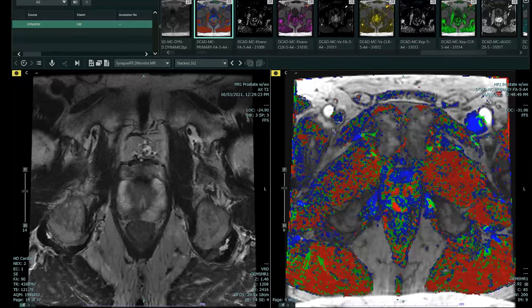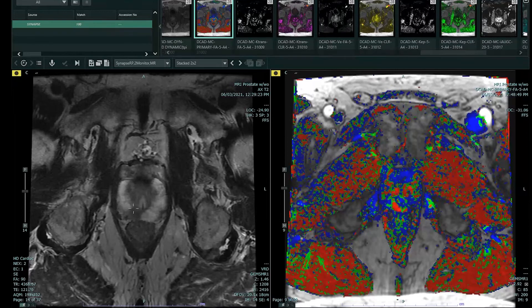This is normal-looking peripheral zone prostate tissue on the right, and then on the left the same whitish-grayish signal. And this is a high-suspicion lesion — a dark lesion in the right posterior peripheral zone. This is abnormal.